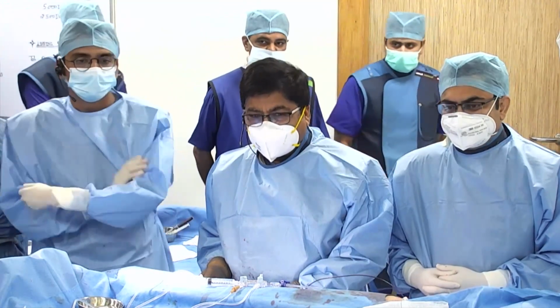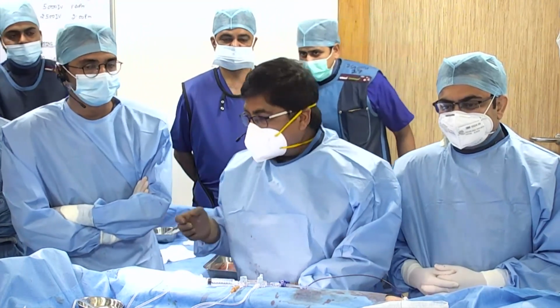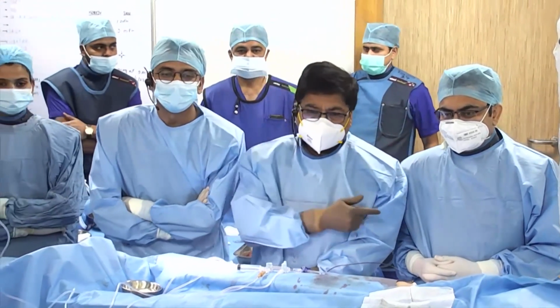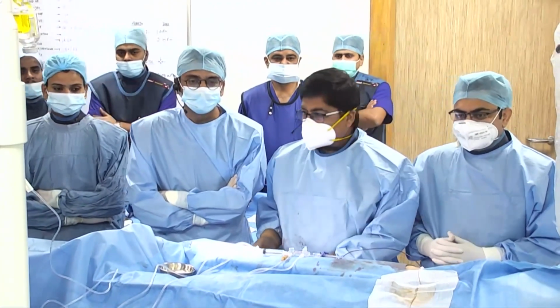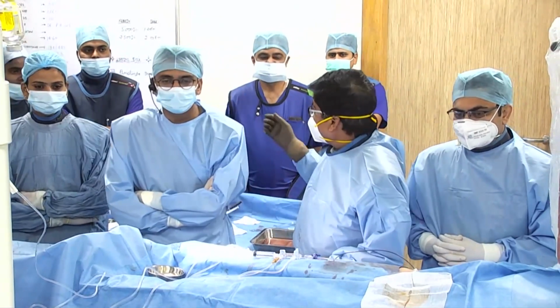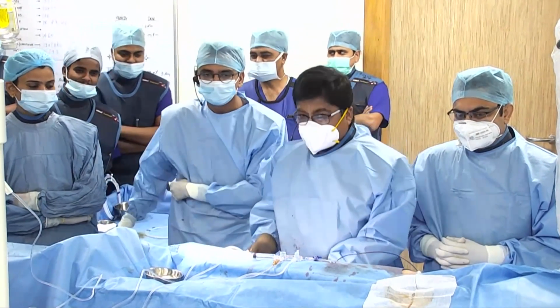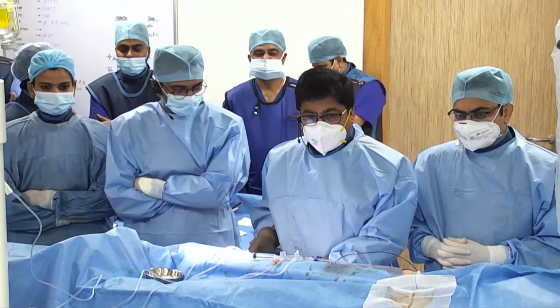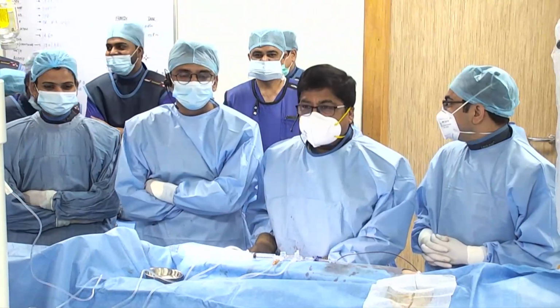So, actually, I'll just introduce my co-operators. Dr. Danish is on my right, and Dr. Vaibhav, two consultants with us, and Mr. Iqbal is our chief technician, and Virender and Sagar, and nursing Archana. So I'll just tell you the case.